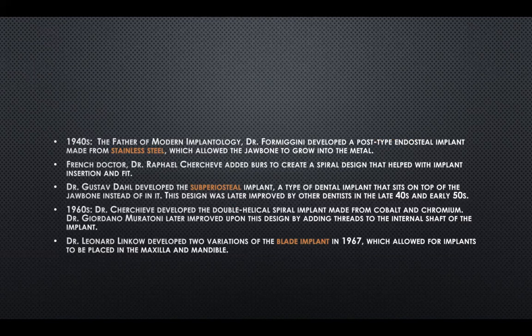And after that, as we went to the 40s and 50s, there was the development of the subperiosteal implants and also the blade implants in the 1960s. And most of these implants failed because of either biologic or mechanical issues.